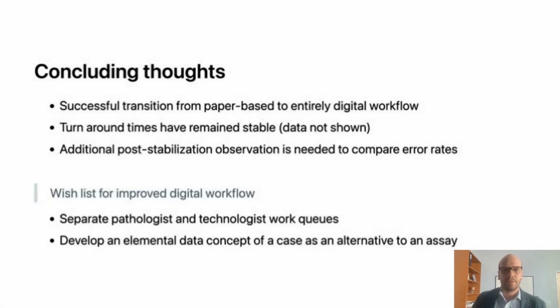So concluding thoughts, we have successfully transitioned from a largely paper-based to an entirely digital workflow. I haven't shown the data, but our turnaround times have remained stable through this transition. This is not entirely surprising. The key bottleneck for our turnaround time is the fact that the technologist typically works in the morning, and the pathologist is not usually available until the end of day to enter their interpretations.